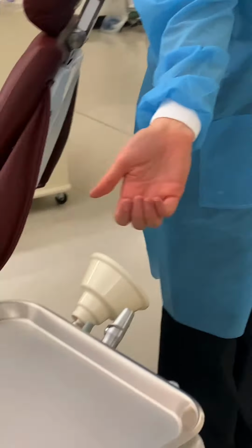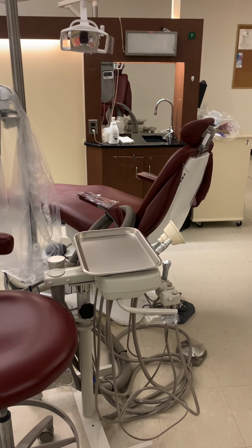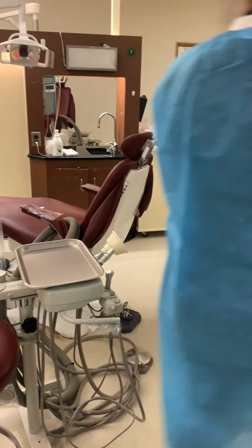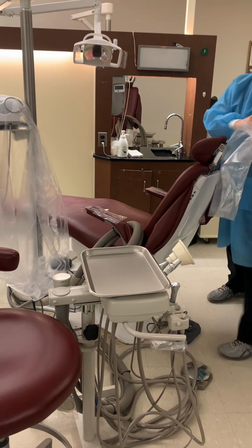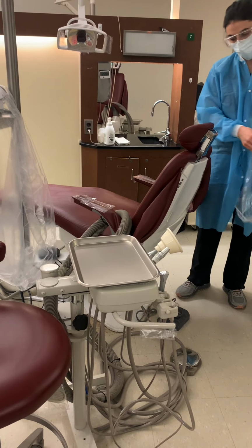Okay. And more high surface areas that would be touched are back here. But instead of wasting and wrapping tape on the whole thing, we're going to use a chair sleeve for that. So that looks like this. And this actually, at the end of your appointment, will double as your trash bag. So stay tuned.